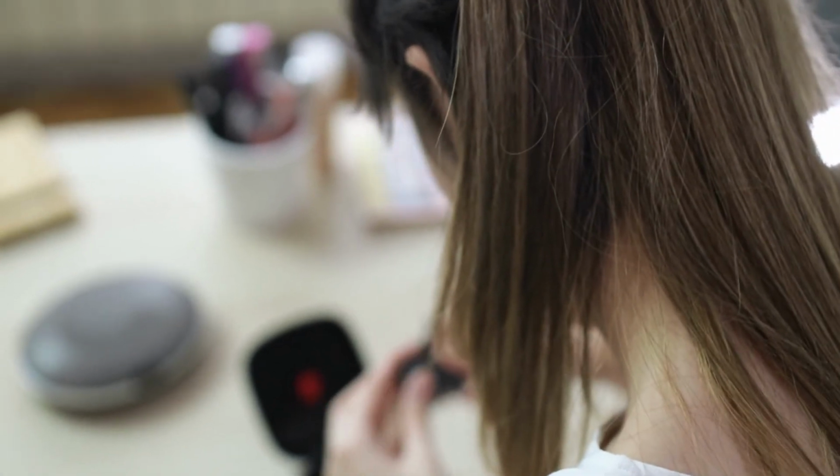But by leveraging electrical hearing, and doing things like the combination of acoustic and electric, or what we call EAS, in these ski slope type hearing losses, we see that particularly. General rule of thumb is that when your hair cell function deteriorates and your outer and inner hair cells go south, the tuning curves and the ability to brute force amplify that signal and get anything meaningful into the cochlea to stimulate the nerve endings gets bypassed in a cochlear implant, by directly stimulating the viable spiral ganglia cells in the modiolus of the cochlea, and using really improved speech coding techniques and other things that have advanced over my tenure as an audiologist.